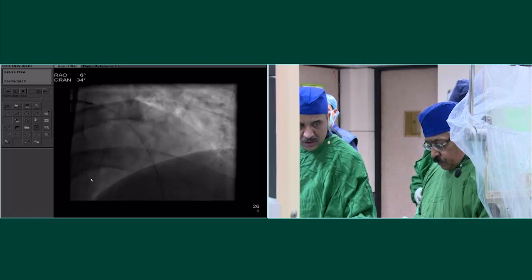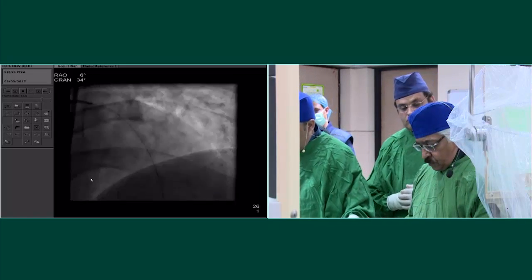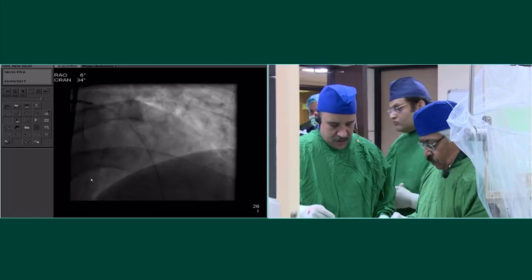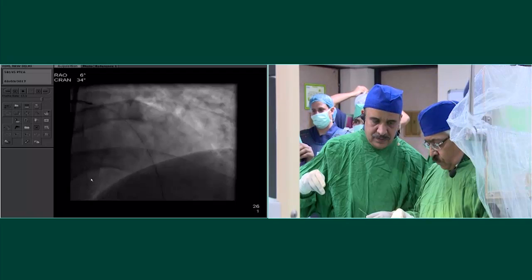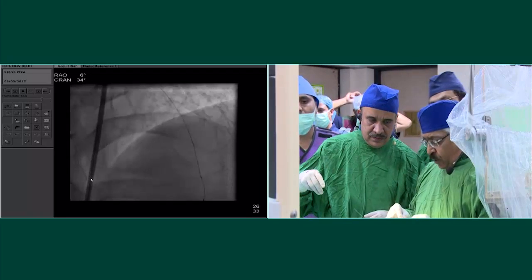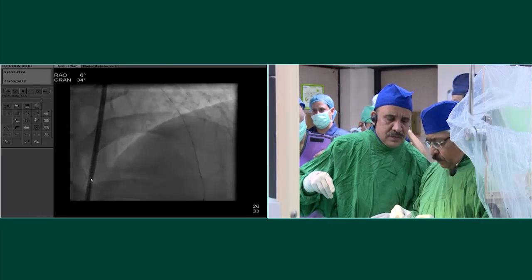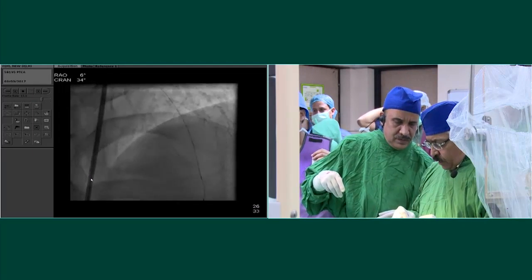And in general, when we are using the cutting balloon, Ashok, for the preparation of the lesion before BVS implantation, do you move directly from the cutting balloon to the BVS, or do you use a regular balloon after the cutting? Yes, because here, because I was 3.5, I'd be quite happy to actually go through. The cutting balloon had expanded completely. I'd actually be quite happy to go with the BVS directly now.